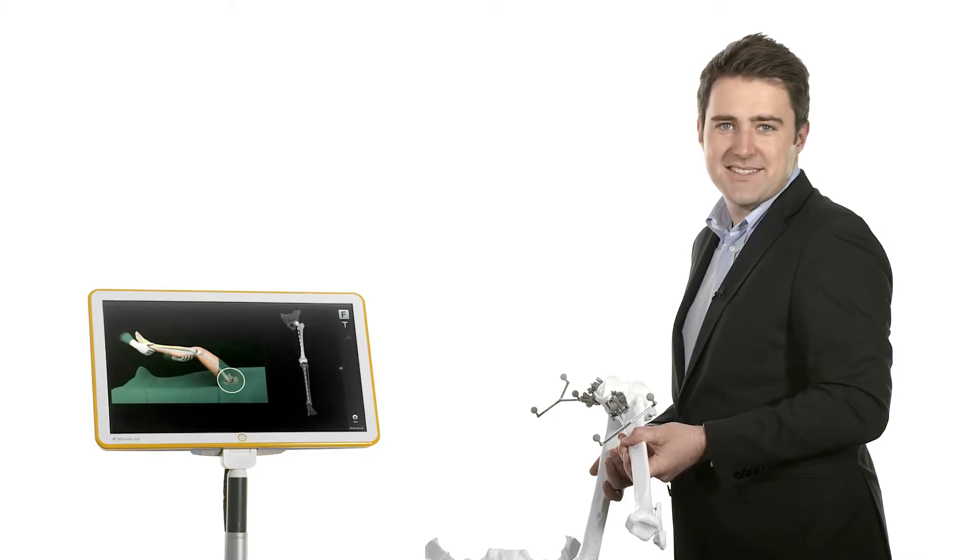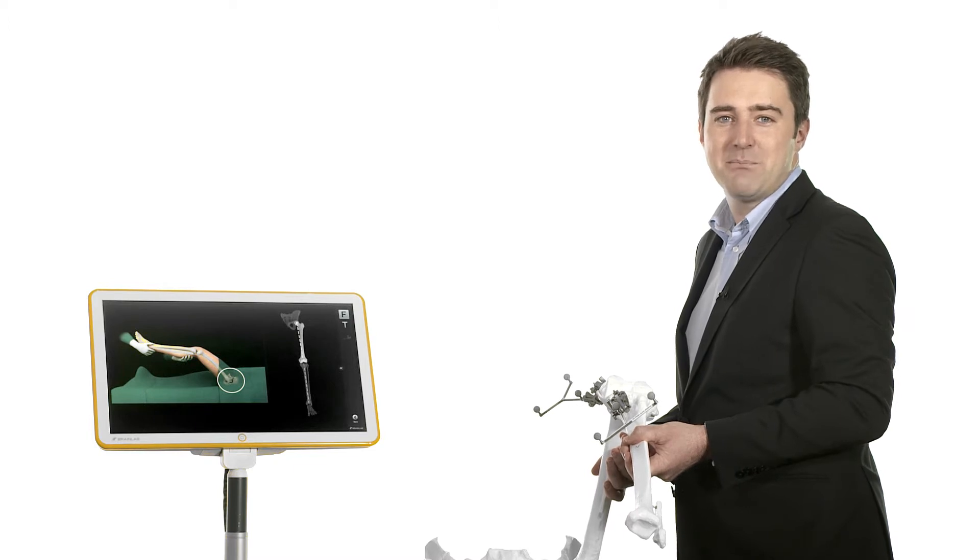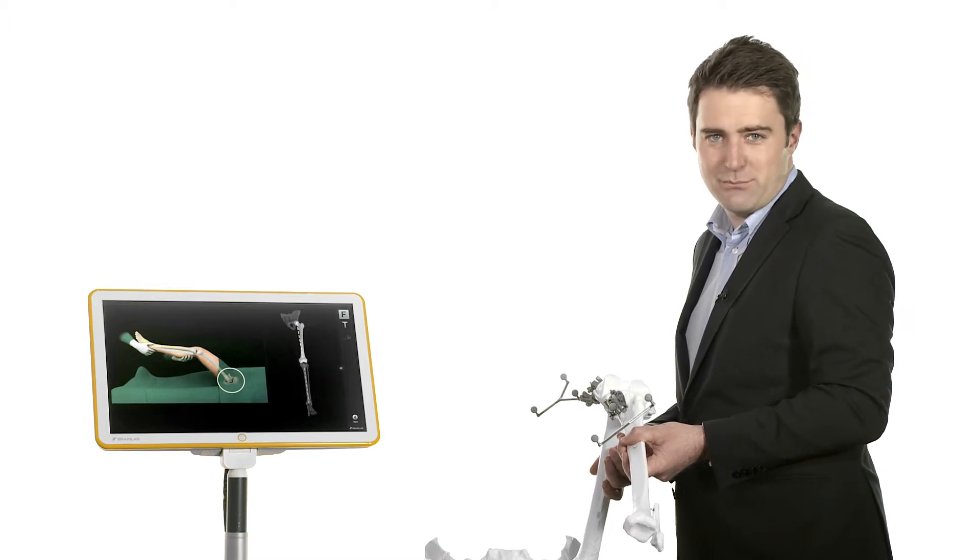Registration steps and system interaction with Knee3 have been streamlined and minimized, resulting in an even faster registration process.